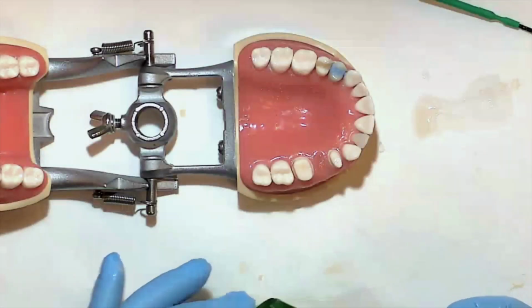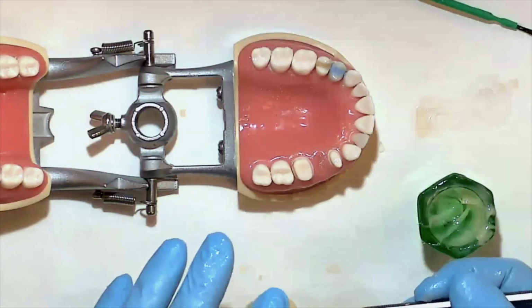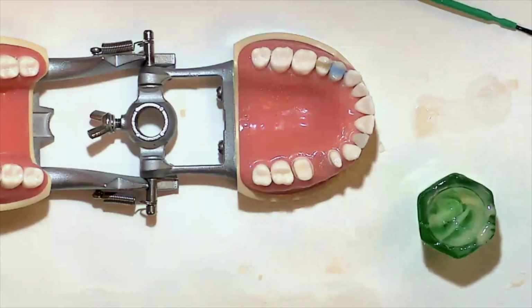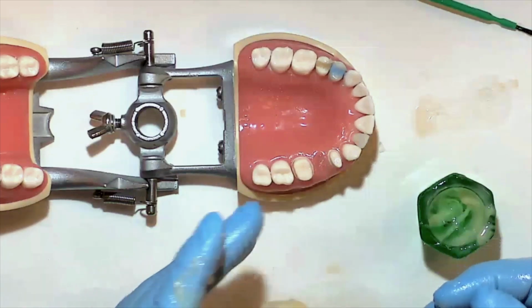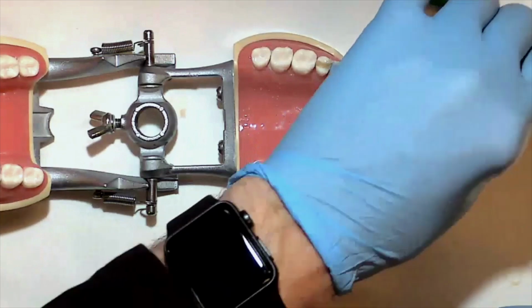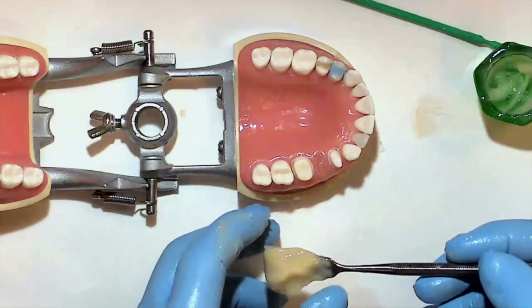Our acrylic is now ready, and we've lubricated our fingers with some Vaseline to prevent it from sticking as we mold the acrylic into an oblong kind of shape. And we're going to place that over the 3 teeth.